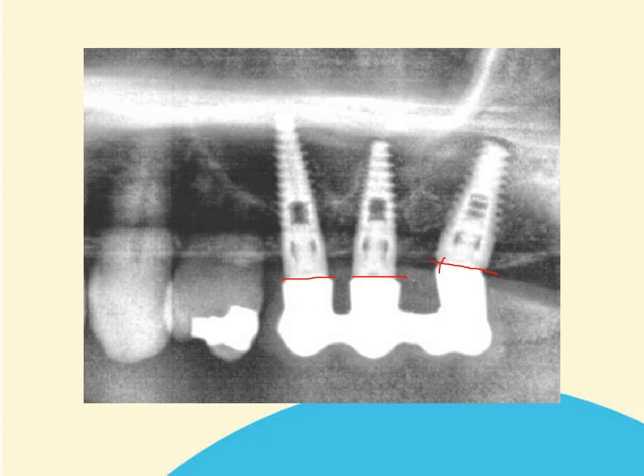These two implants are not platform switched, and in fact the abutment is slightly larger than the fixture itself. Again, this is an indication of a series 2 type of connection. On the anchor lock range, the abutment would never be larger than the implant diameter. It will either be equal or slightly smaller, but never larger. So if our abutment looks larger than the implant diameter, then this most likely will be either an early series 1, series 2 or EasyPlant.